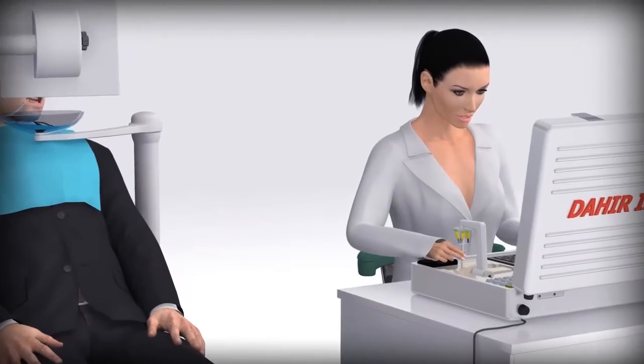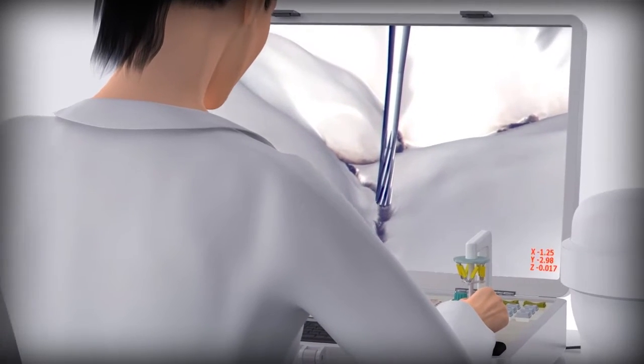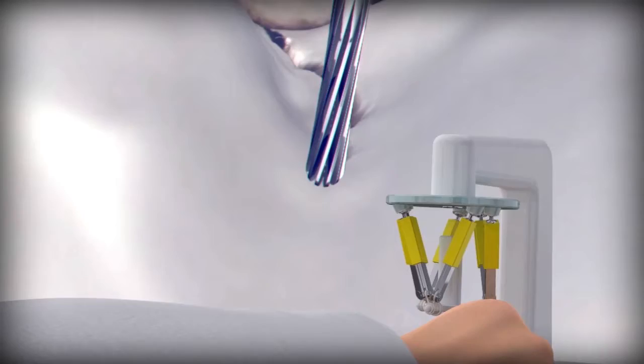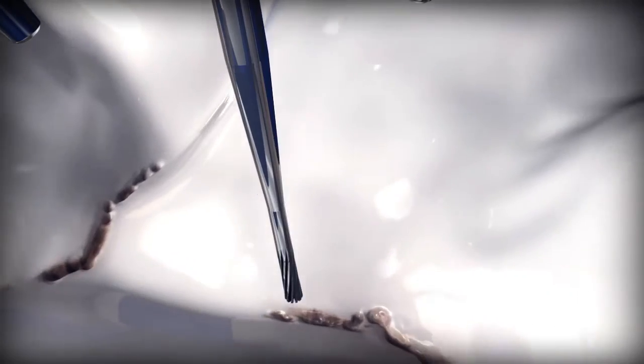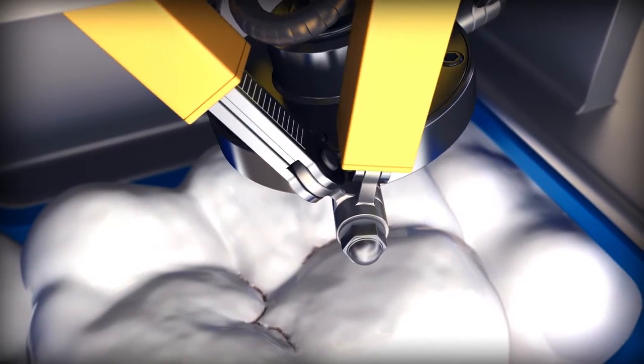The device is controlled using a controller that transmits the movements of the technician's hand via servo motors. The technician's hands are placed comfortably on a desk, and the movements and force transmitted to the device are amplified by a magnitude set by the technician. The drill's movements are thus very precise and carefully calibrated.